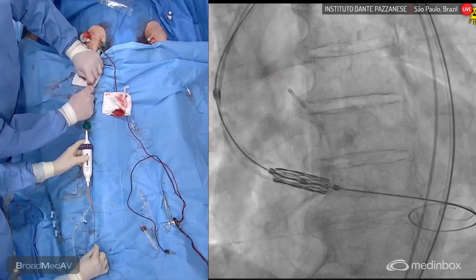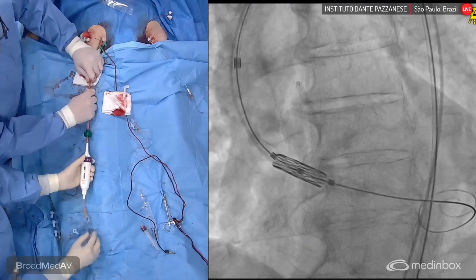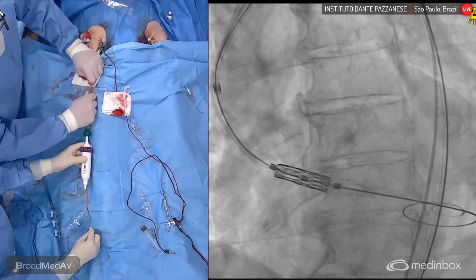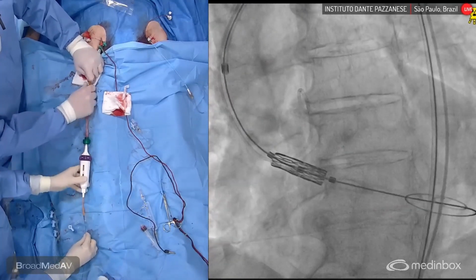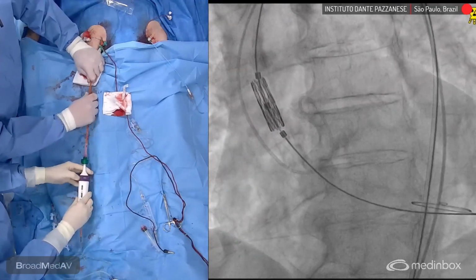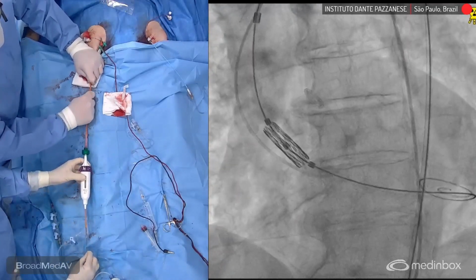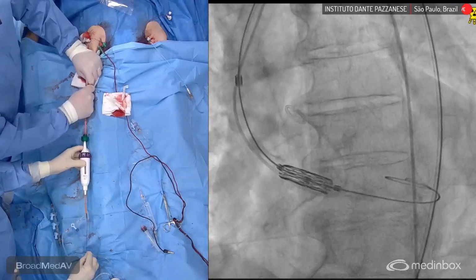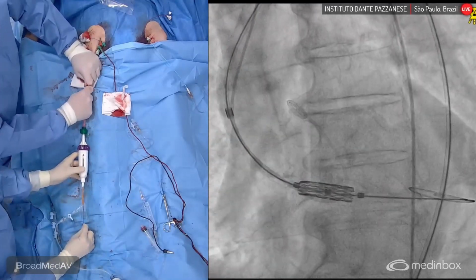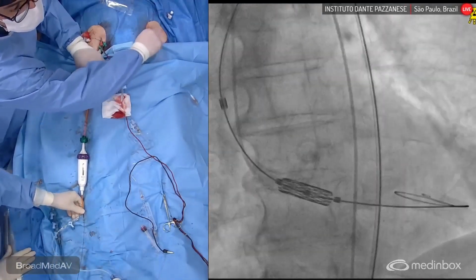It's very calcified. The calcium was more than 3,000. Doing more flexion. No. Let's try again with less deflection. I think pull the wire a little bit. Yeah, that's it. Okay, you got it now. Let me change the projection. That's very good.